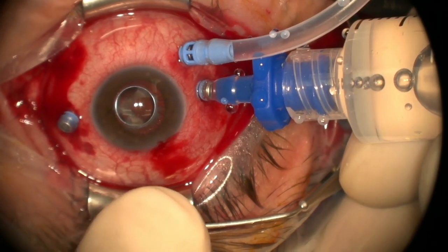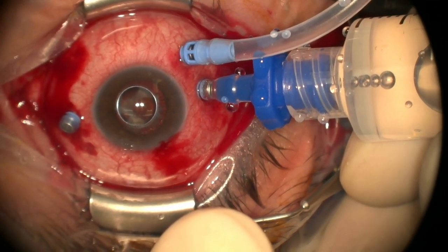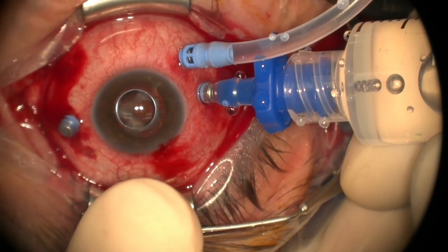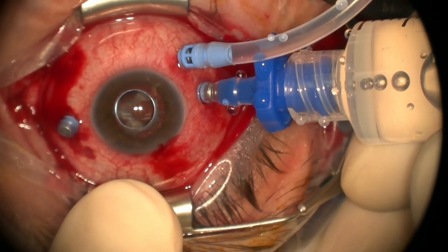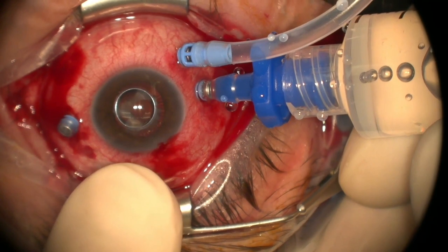The one advantage in peeling the membrane and the macula in this case, it gives a lot of circulation in the eye. And if anything is open or not secured in terms of retinal breaks, we should be able to see the retina re-detaching while we're still in the eye and not have to wait to find it tomorrow or a week later, which is always very disappointing. If we find it while we're here today, we'll still peel the membrane and the macula.